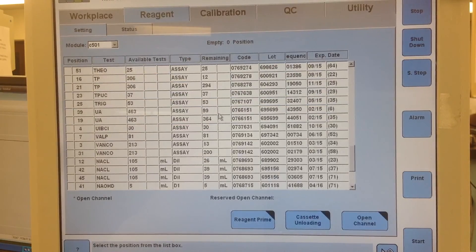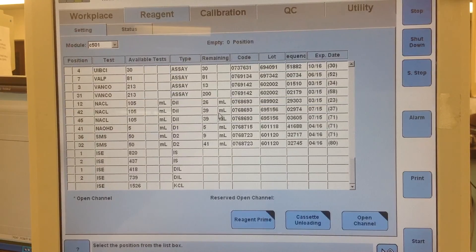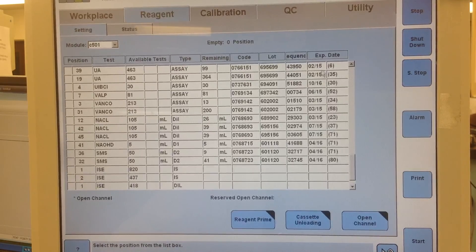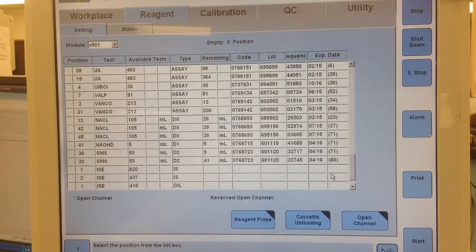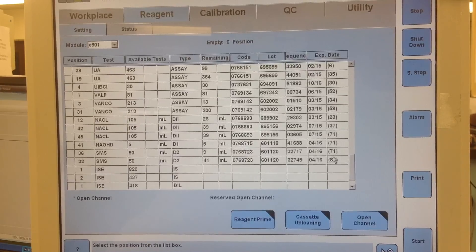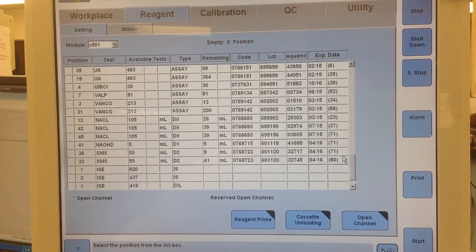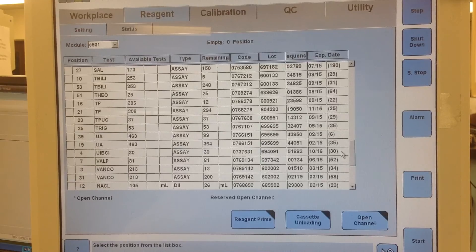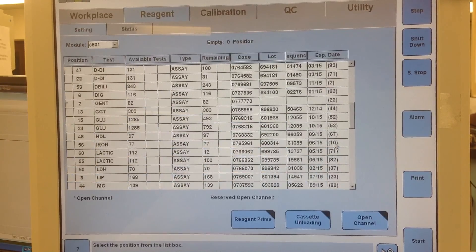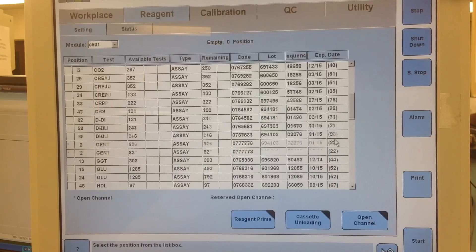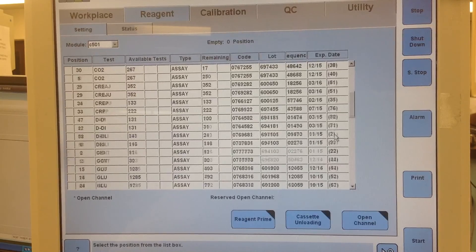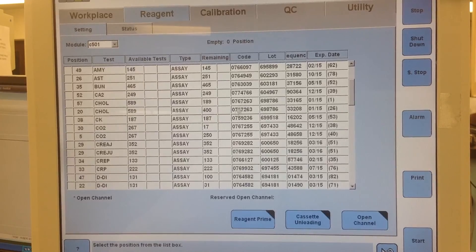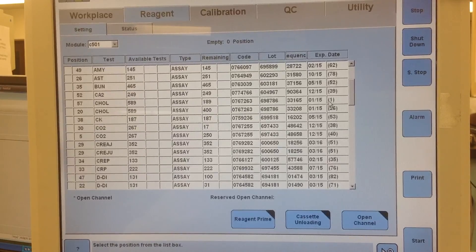After that I'll scroll down and check all that, and the next thing I want to do is come over here to the expiration date and check for any of the reagent packs that have either already expired last night at midnight or will expire tonight at midnight. So you just quickly scroll through. It shows you all the days it has left until it expires. For instance, direct bilirubin only has two days left, so cholesterol only has one day left.